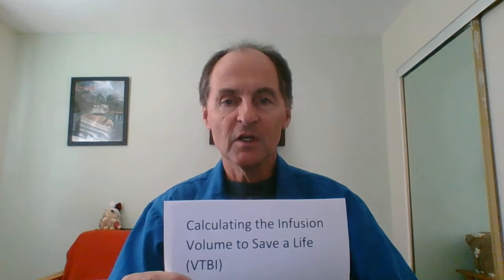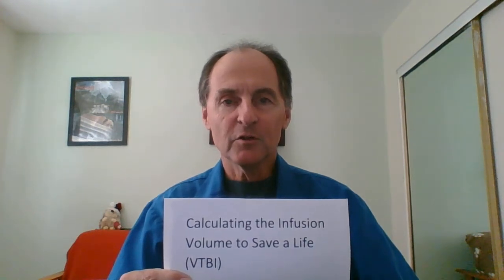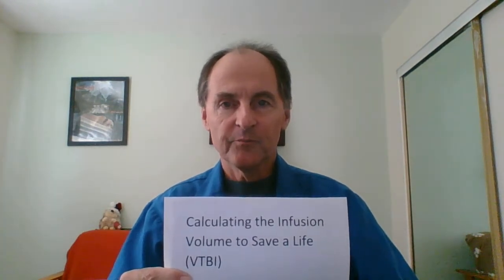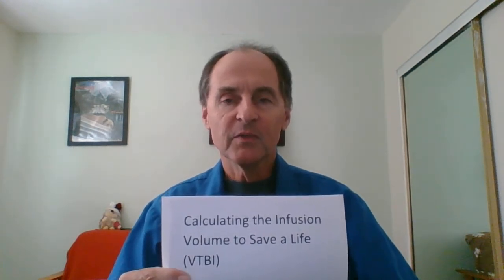You simply add 30 cc's to your smallish bag of say 50 cc's. That'll give you 80 cc's to program into your volume to be infused section of the IV pump, and you should be able to give the full dose of the medication, antibiotics or whatever. Once you get up to 100 cc's or more, you probably need to think a little deeper and do a more complex calculation even. And the formula is as follows.